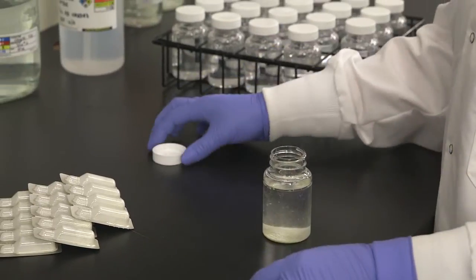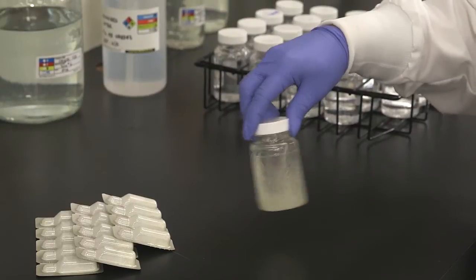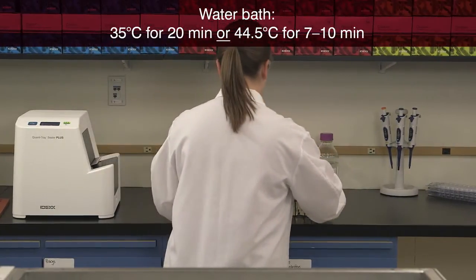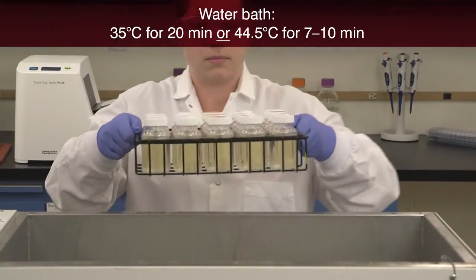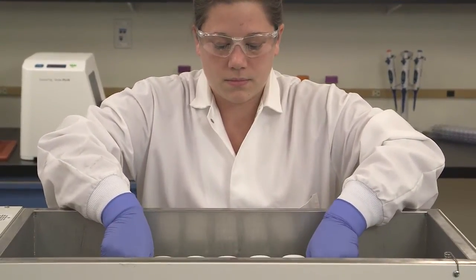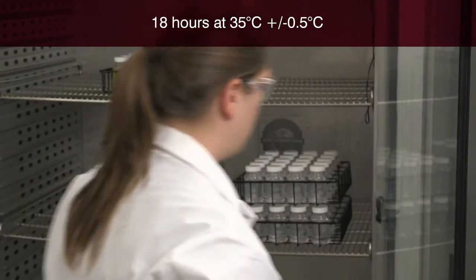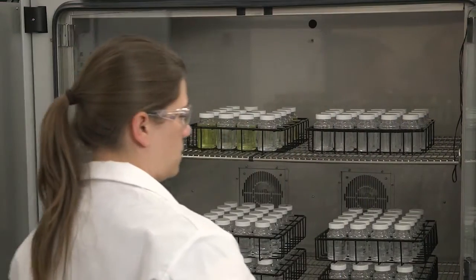Snap open the reagent pack and pour the powder into a 100 ml water sample. Cap the vessel and shake to dissolve the ColAlert 18 powder. You may notice the water sample has a slight color tinge. If the sample is not already at 33 to 38 degrees centigrade, place the vessel in a 35 degrees centigrade water bath for 20 minutes, or in a 44.5 degrees centigrade water bath for 7 to 10 minutes. Incubate the sample for the remainder of the 18 hours at 35 degrees centigrade, plus or minus 0.5 degrees centigrade, or according to your local regulations.